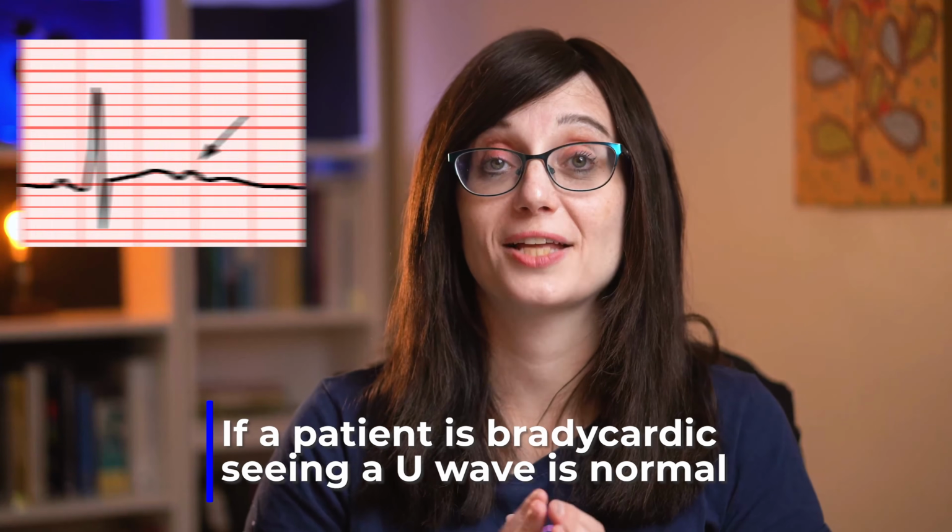So we've gone through a systematic approach to looking at every single pediatric ECG, along with some specific things that you should be focusing on if you know the particular thing you're worried about.